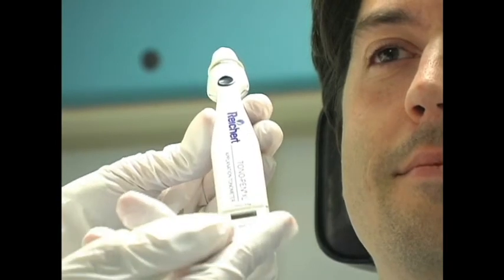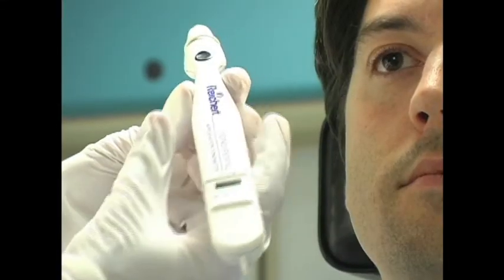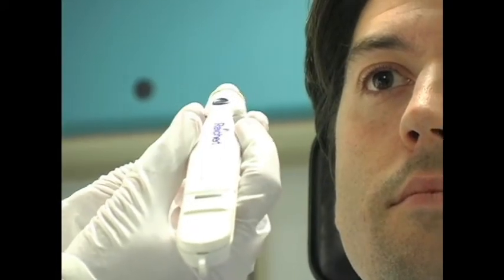Also note the error of the reading by identifying the location of the small hash mark in relation to the error scale located next to the screen. Optimal measurement requires an error reading of 5%. Press the operator button again, and after the beep, repeat the measurement.